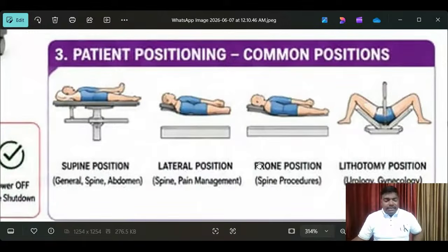So that's why, see, for all these operating purposes, a technically skilled engineer is required, because life is very important, and we should not play with our life. Life is very, very important. That's why we have to be serious. That's why today I am giving these instructions, so that you don't get into trouble.